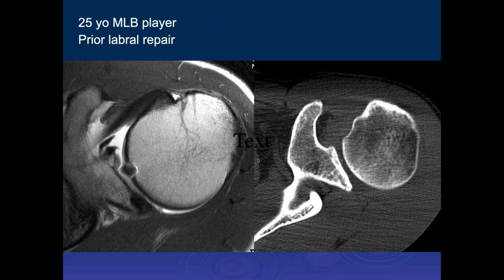Here's a prior major league baseball player who had surgery with a pro SLAP repair. You can see a lot of metal artifact on the axial T1 weighted images in this arthrogram sequence. Notice how subtle the small fleck of metal is on the CT scan versus how much more sensitive MR is to small metal artifacts than CT.